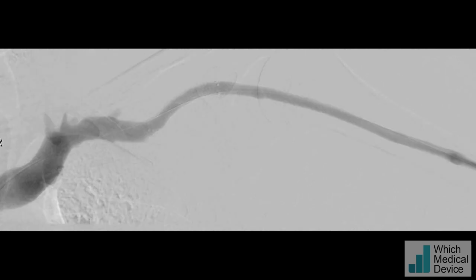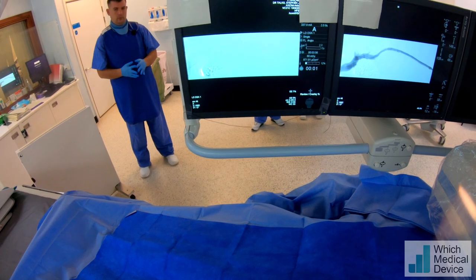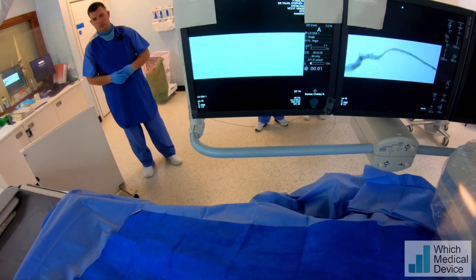I'm very happy with that. You can see the flow is very rapid, there's no collateral filling, and the diameter is pretty much the same as the feeding and draining areas of vein.